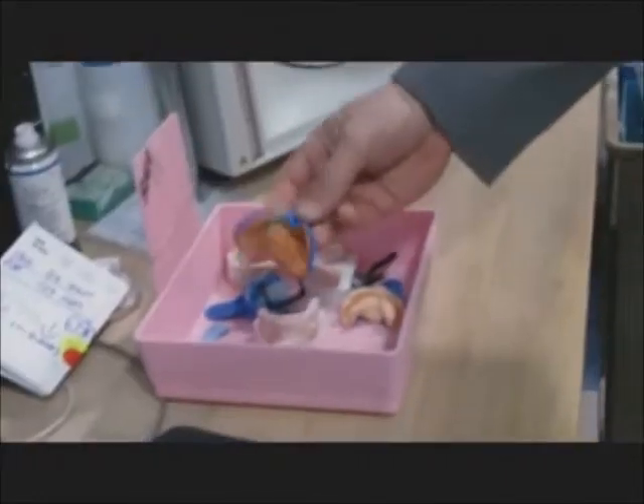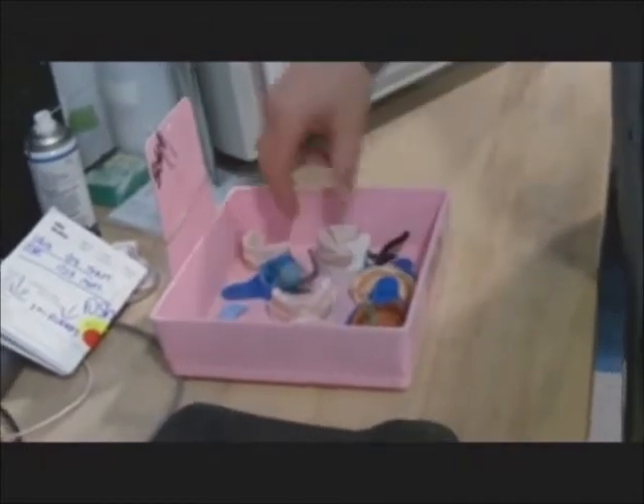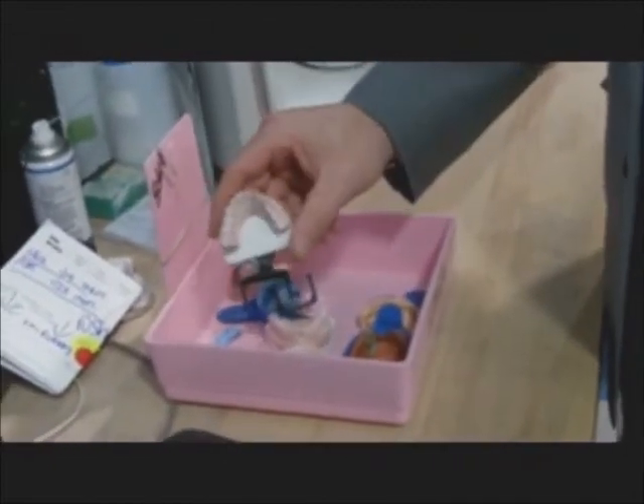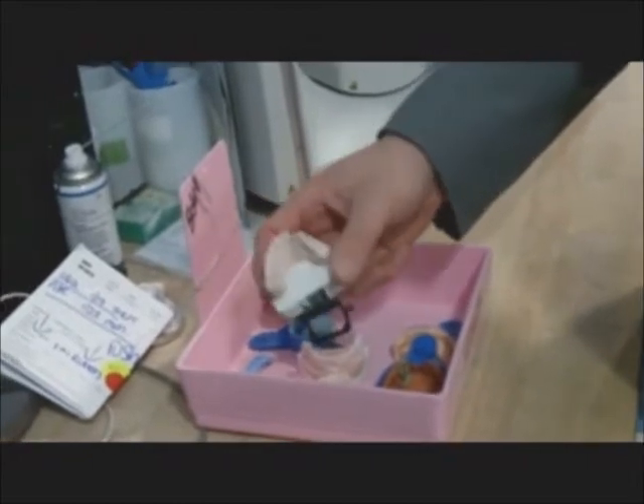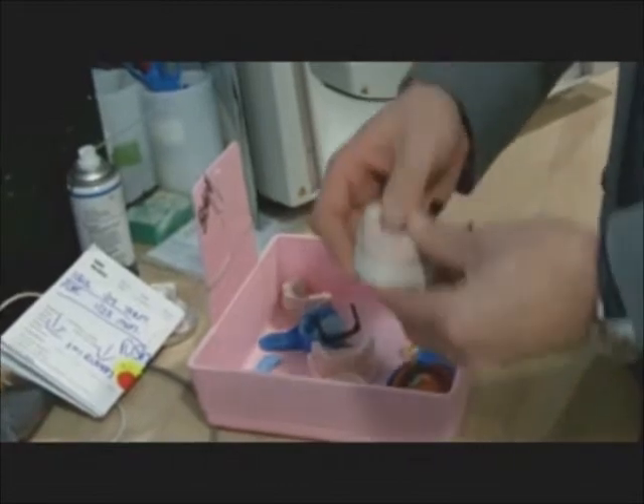Well, this is your basic impression — your regular PVS impression. From there, what we do is use your conventional model techniques: stone pour models, dyed Pindex, so everything is removable, so you can scan the information.